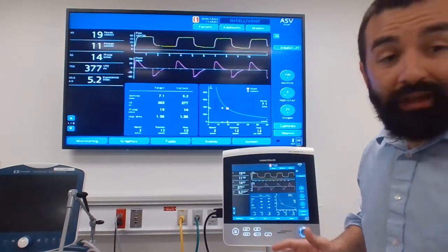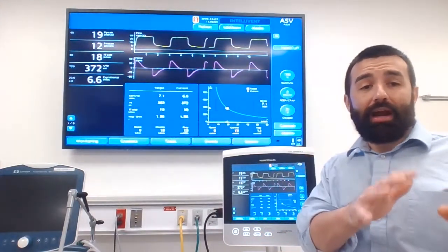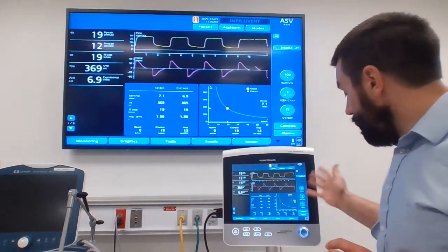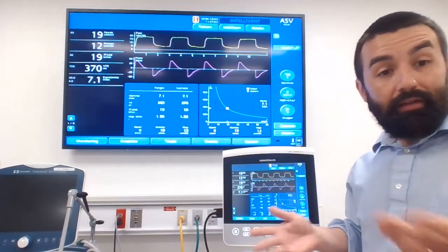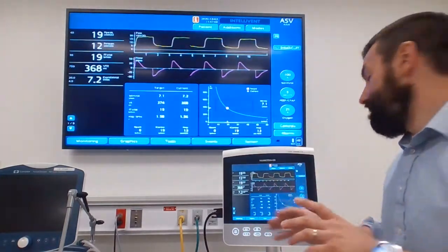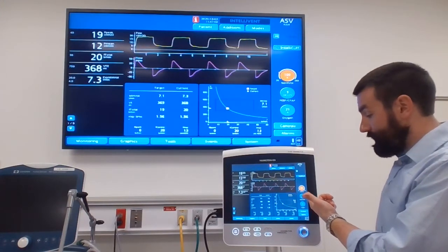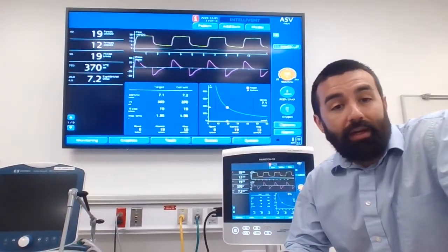But if you want your patient to get more mandatory breaths from the ventilator, and you want them to maybe not have that drive to breathe so hard spontaneously, we could try and increase that percentage minute ventilation as high as we needed to let them rest and let the ventilator do most of the work. As you see, this does go up to 350% minute ventilation. All right. What you'll come into problems with is there are times where it cannot reach target.